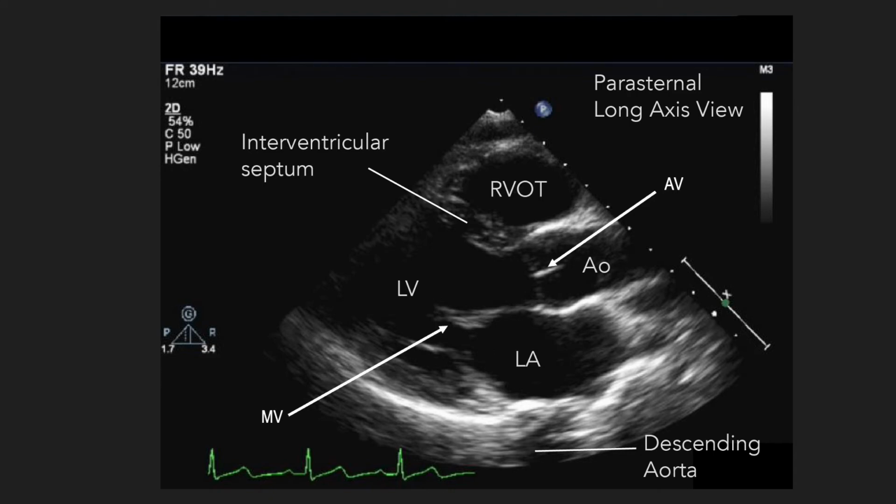Between the left ventricle and the left atrium, you actually had this demonstrated on the last slide, is the mitral valve. So during this part of the cardiac cycle, we're actually seeing the function of the valves, right? They're meant to separate the chambers and make sure that blood's going in the right direction. So this is actually diastole, where blood is going from the left atrium, from the lungs. This is oxygenated blood going from the left atrium to the left ventricle.